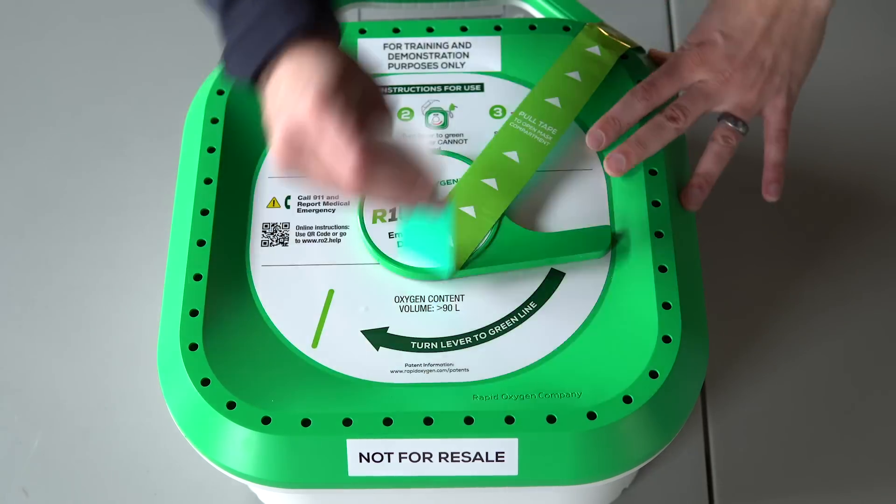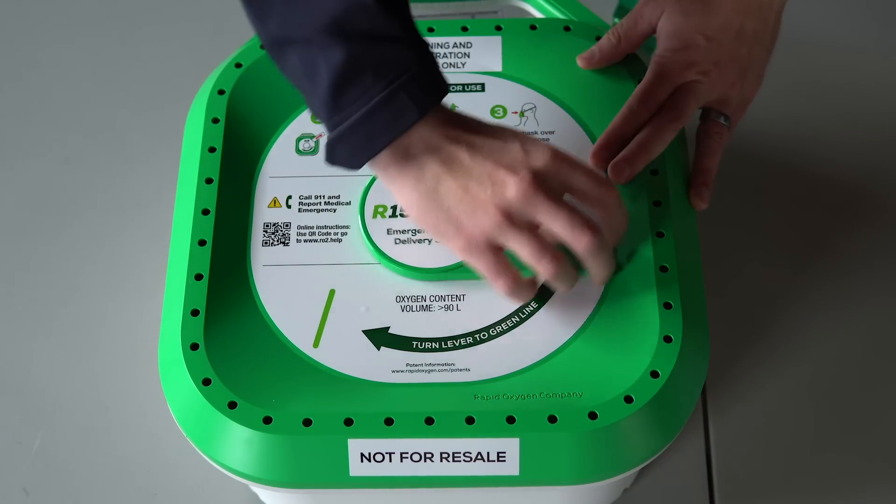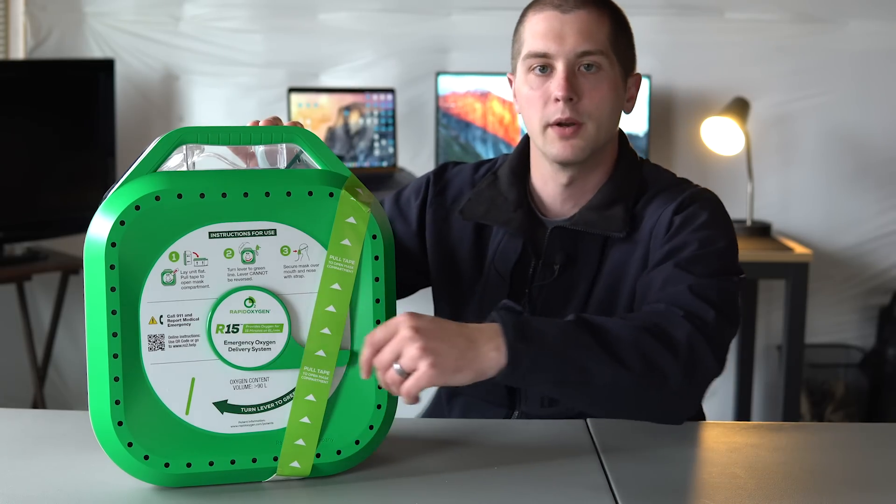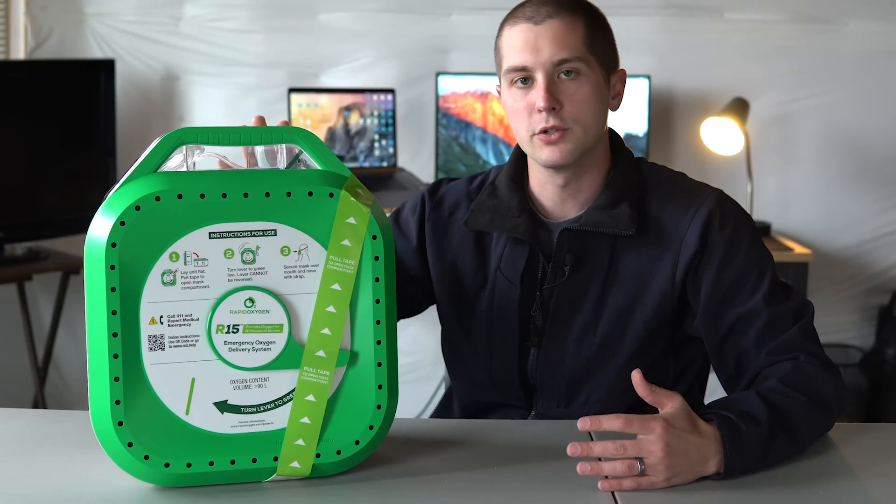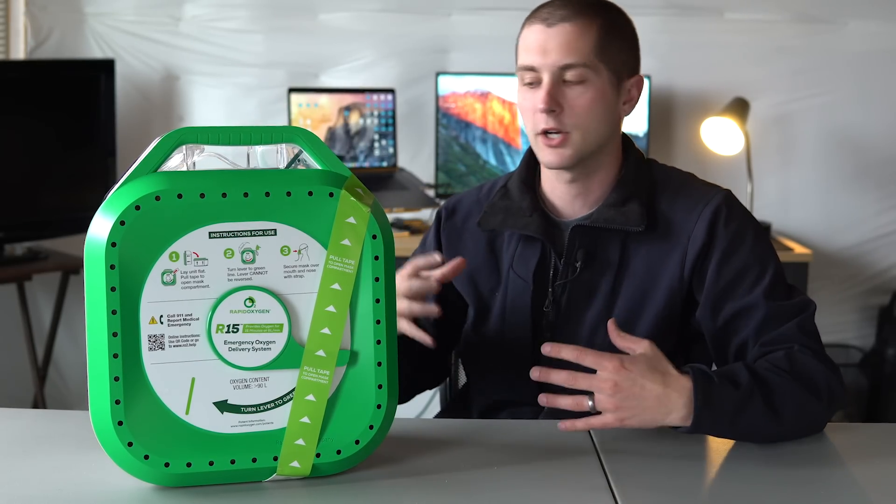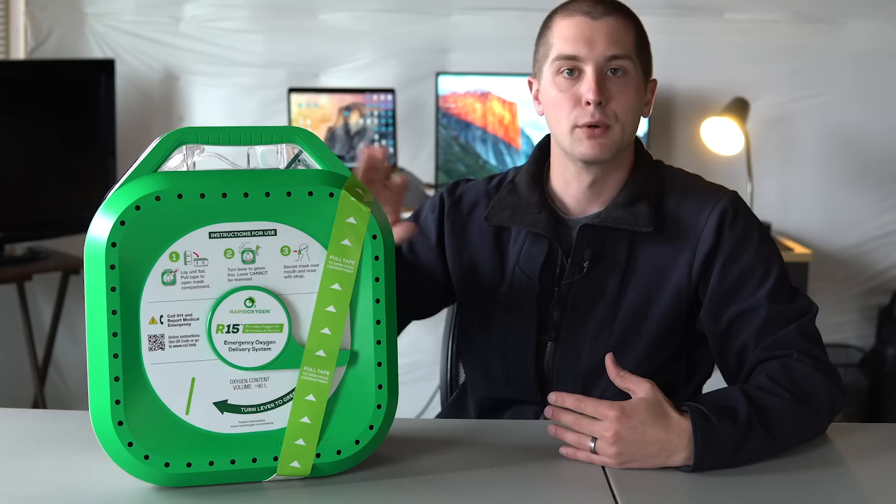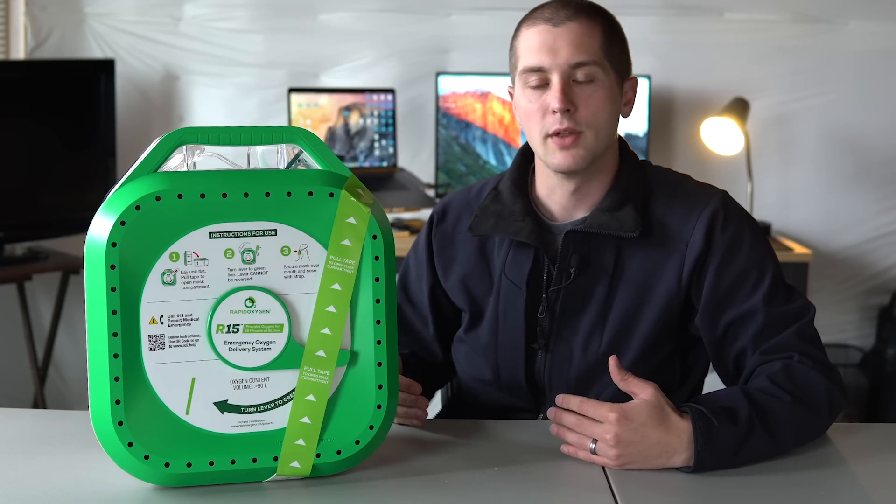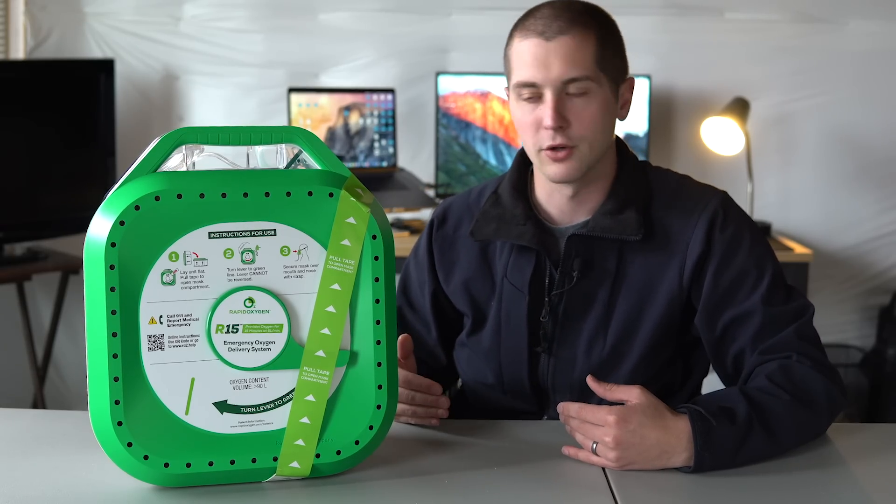When you get there, you can peel this sticker off here, peel that off, and then you take this lever and you rotate it down. And that actually combines all those ingredients and it creates a chemical reaction within this box that produces the oxygen. So that's why it doesn't need to be checked for pressure or anything like that.